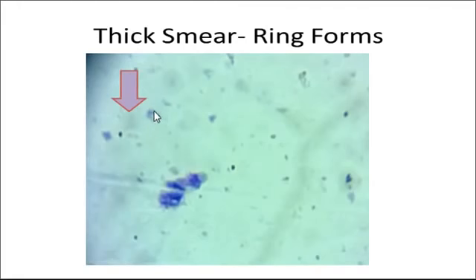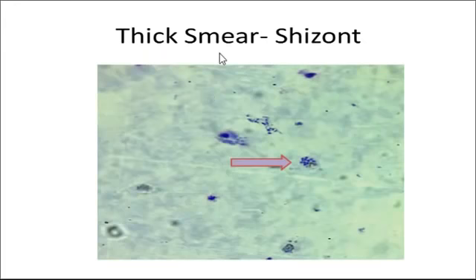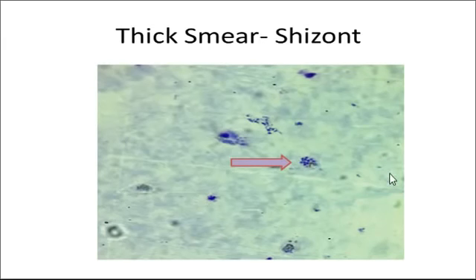We can't always find perfectly formed rings in thick smears, but here we can quite appreciate a ring form. Ring forms are actually early trophozoites — the earliest stage of the trophozoite is the ring form, which occurs when the merozoite infects the RBC. It then progresses to the amoeboid trophozoite and matures further. This is the schizont; even in a thick smear, you can make out the merozoites inside — there can be about 12 to 24 merozoites in each schizont.